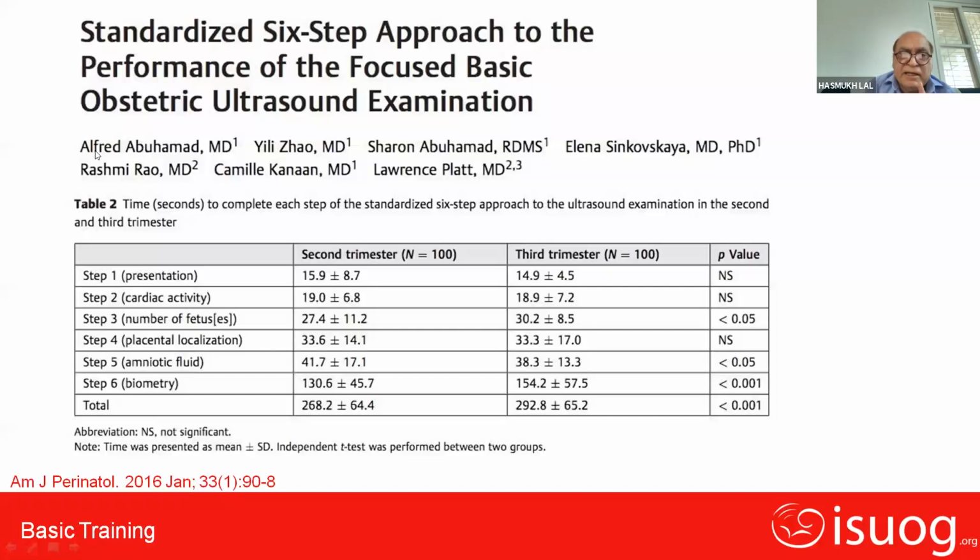And of course, placenta and amniotic fluid will be discussed very elaborately by Dr. Pramodini Swai, so things will come again and again. You will have a lot of chances to learn things again and again. Many of these, like this book, this standardization, and this whole 6-step approach, have been designed by Professor Abu Hamad. And here it says time in seconds to complete each step of the standardized 6-step approach to the ultrasound examination in the second and third trimesters.